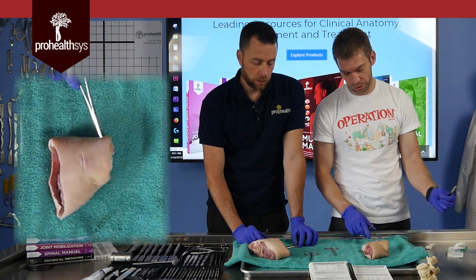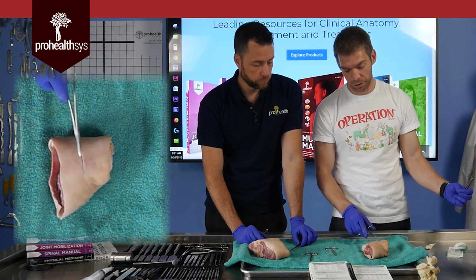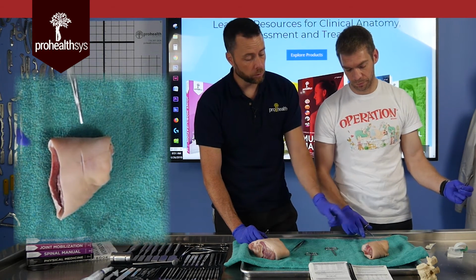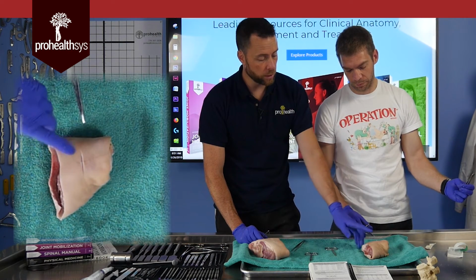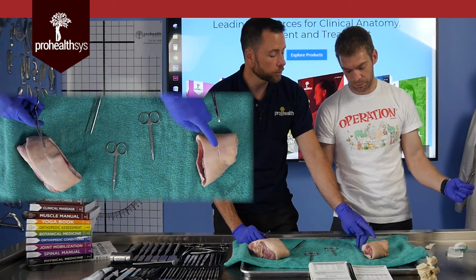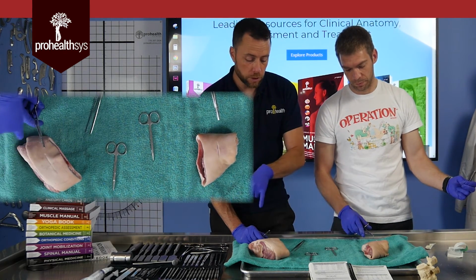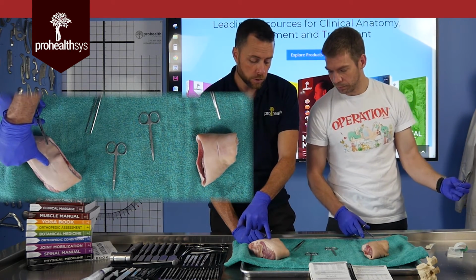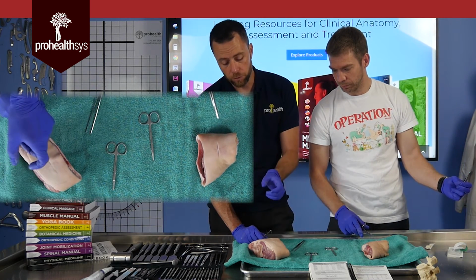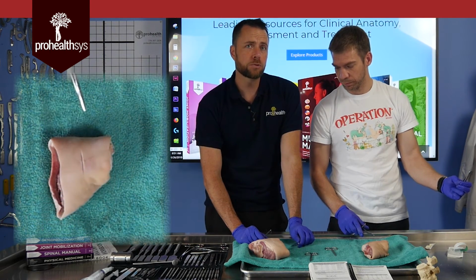So next thing that we're going to do is the thing that makes you look really cool, tying a suture effectively. Just before we do that though, I want to point out one thing. If you look at Dr. Vargo's incisions right here, where he's actually gone through with the needle, you can see how his punctures are really close and equidistant from the actual scar. That's what happens when you take your time a little bit more through this. If you rush through a little bit more quickly, you can see how this one is close to the edge and this one's a little bit further away. So again, that can change the pull of the fascia on either side and potentially offer differences in scar tissue formation. Depends what your goal is.